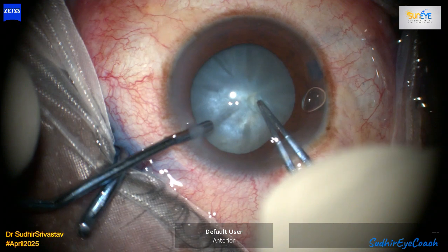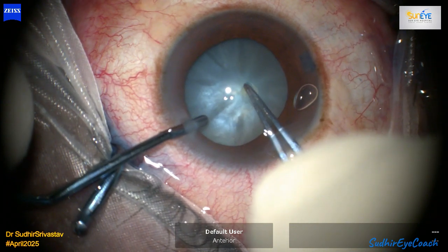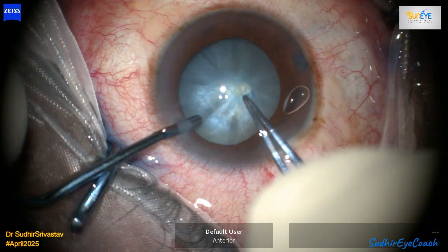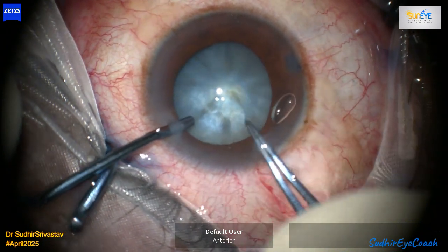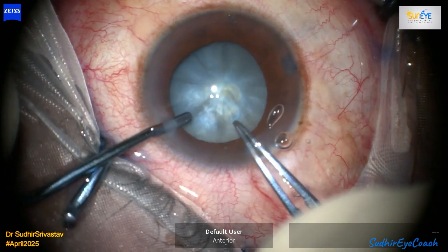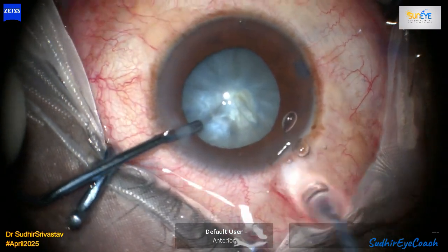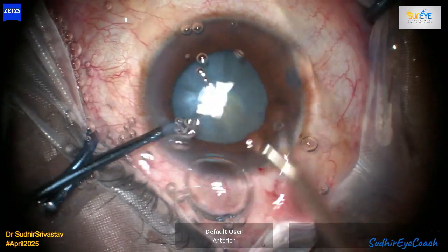In this particular case, I started with the same approach, but the initial capsulorhexis ended up being only around 5 mm because the pressure was very high and there was a risk that the rhexis may go out towards the periphery. During the manipulations, the Argentinian flag sign and other complications might happen, so I decided to proceed carefully.